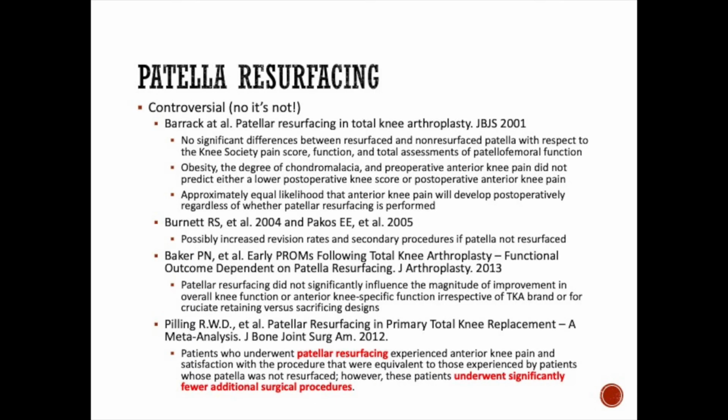Patellar resurfacing. It's often considered controversial, but really it's not. There's virtually no literature to support not resurfacing it, and study after study that does look at this shows that there's either no difference in resurfacing or not, but if there ever is a difference identified, it's that revision surgeries are much lower in patients that had it resurfaced. So in reality, without increasing complications substantially, it does help prevent revision surgeries. You should resurface the patella.